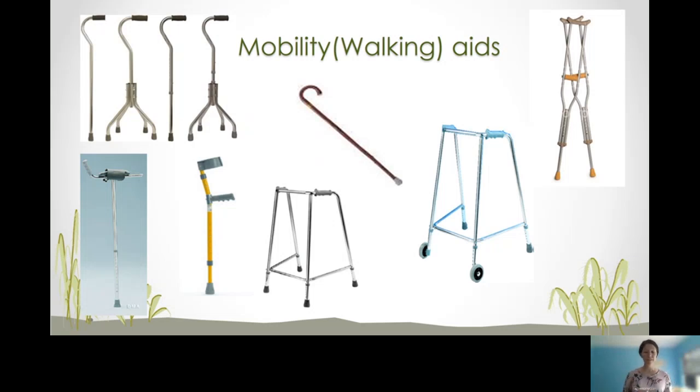Right to that is a walking frame. Take a look at that big base of support compared to the single crutch, or even two crutches. And the last one on the screen, and that I want to show you for today, is the walking frame with wheels on.